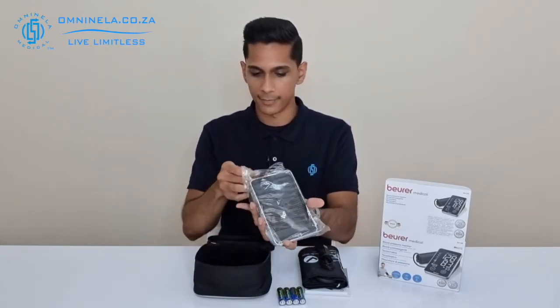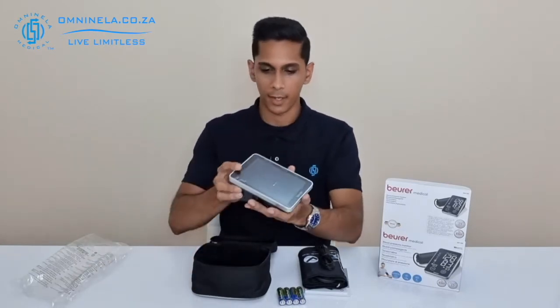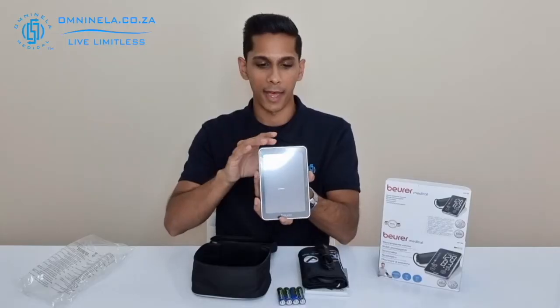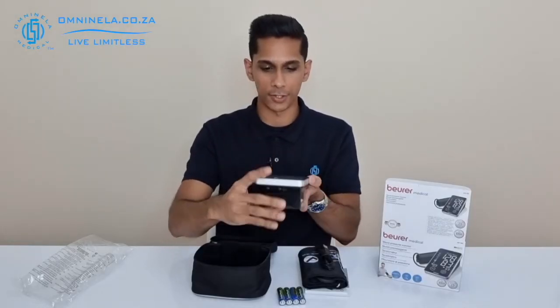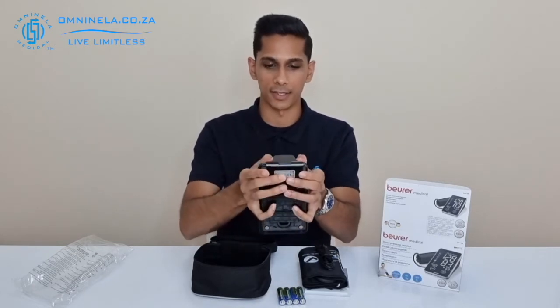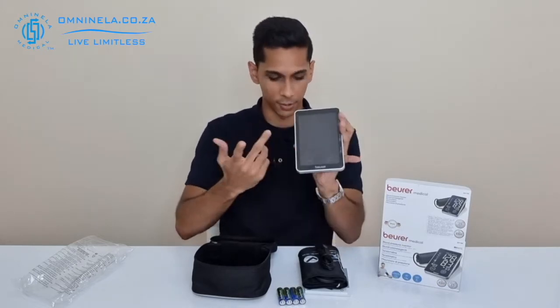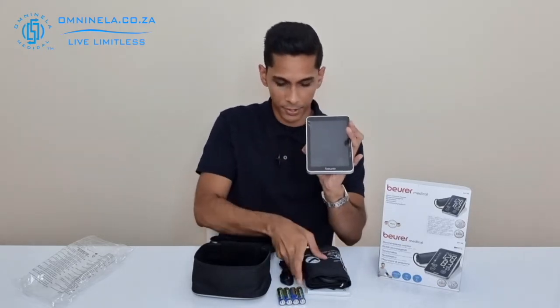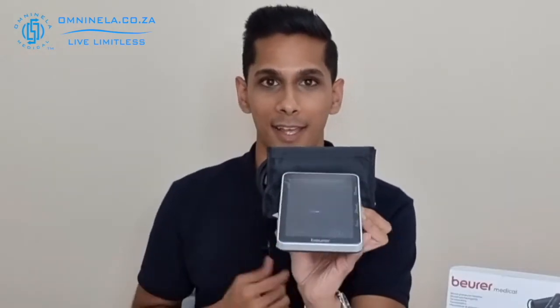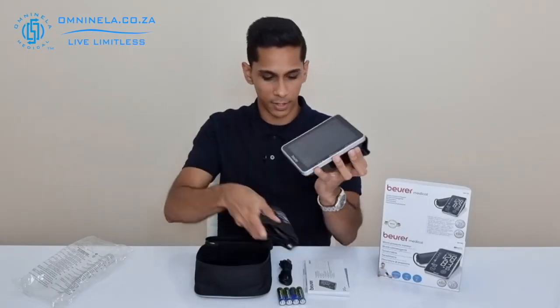Next we have the device itself, and immediately we notice the large screen on it. Looking at the back panel, one interesting thing is that it doubles as a cuff holder — so if you know you'll have the cuff out quite often and you're going to be testing regularly, this is a handy place to keep your cuff so that it stays together with your monitor.